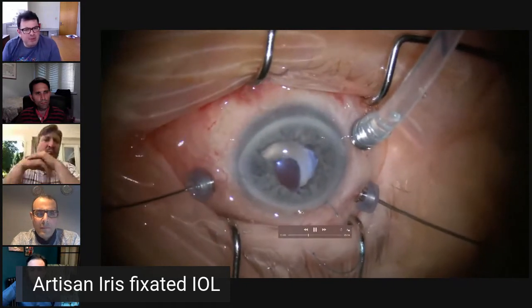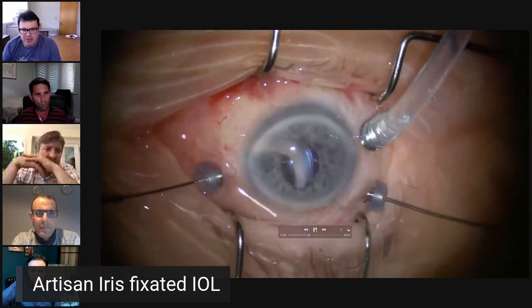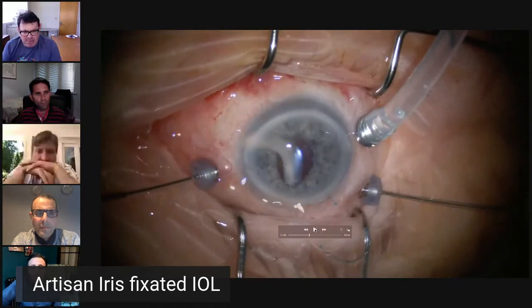Pepe, sorry, can I interrupt you here? So is your infusion on or off as you pull that out? Because that's usually a bit of a tricky bit, right? Sometimes if you leave it on, then the iris prolapses. What do you do? Totally correct.